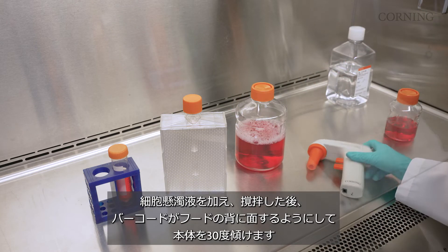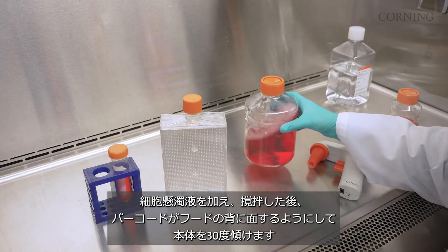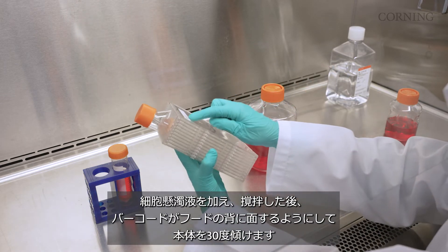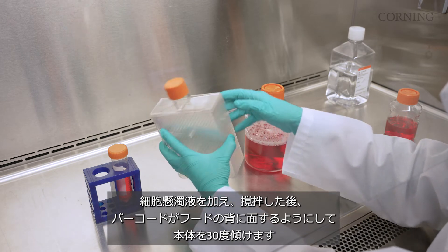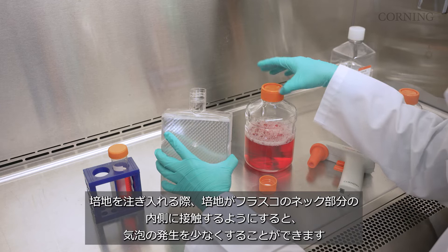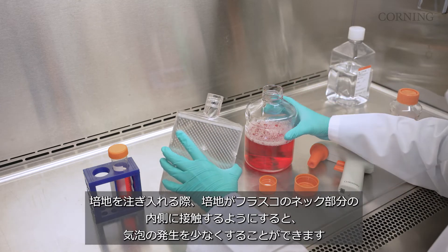Add your cell suspension and stir the solution. Then tilt the hyperflask vessel on its back corner at a 30 degree angle with the barcode facing the back of the hood. When pouring, try to make as much contact with the inside of the flask neck to reduce foaming.